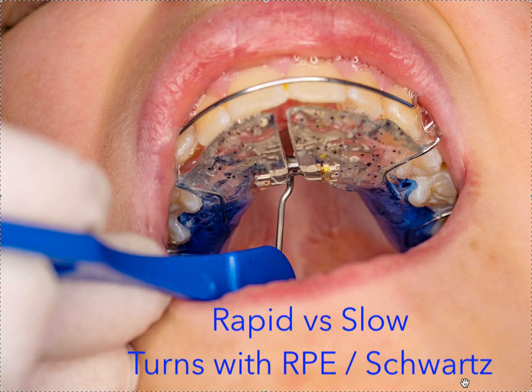Like I said, the frequency is going to change. It might change every month. So we start off with either 2 turns on the top, 1 turn on the bottom, 2 turns on the top, 2 turns on the bottom, or 1 and 1, depending on the age, the pubertal growth spurt. And I have tons of videos on how to choose that. And then when the patient comes in, we reassess. We might change it up, so the patient has to come in.